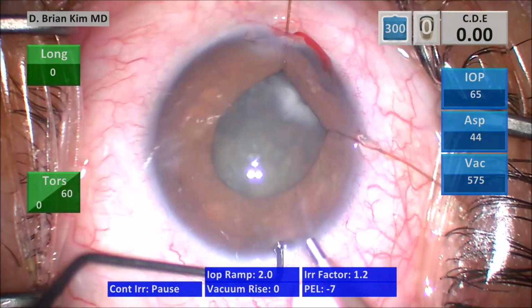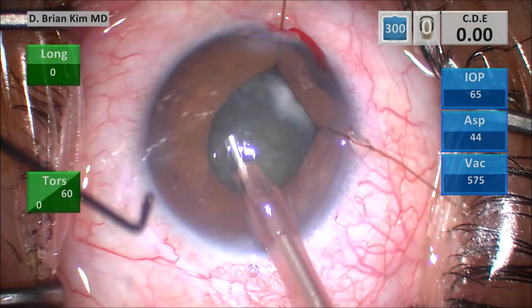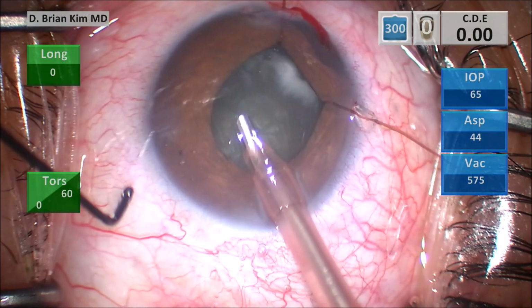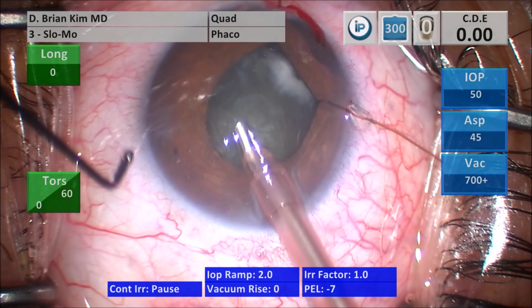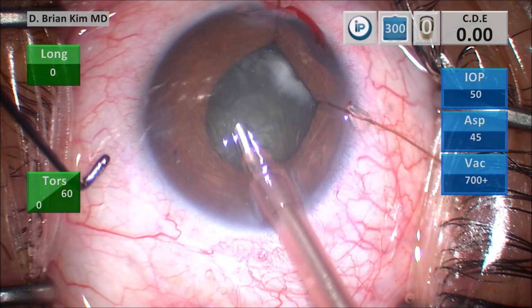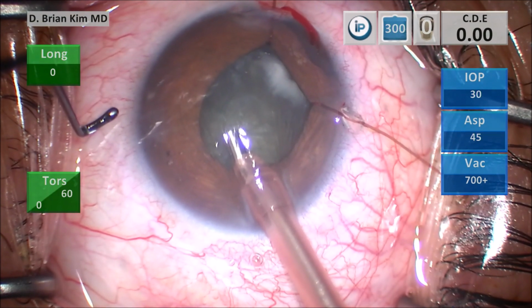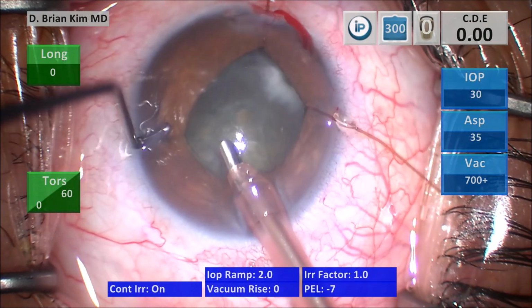Lifting the incision with the chopper, going in with irrigation off to minimize Descemet's trauma. Because of the potential zonular problems, I try to go to a low flow setting here. So I'm asking my nurse to adjust the IOP to get it to a really low flow. So we're going to go ahead and get started and just see how the chamber looks. The chamber is fairly shallow. So far, I feel like I can just handle it as it is.